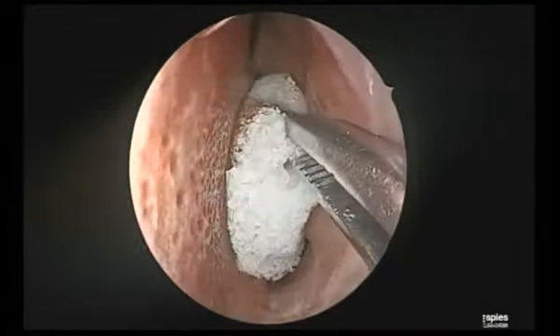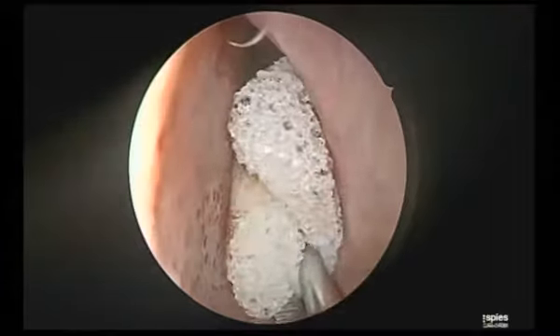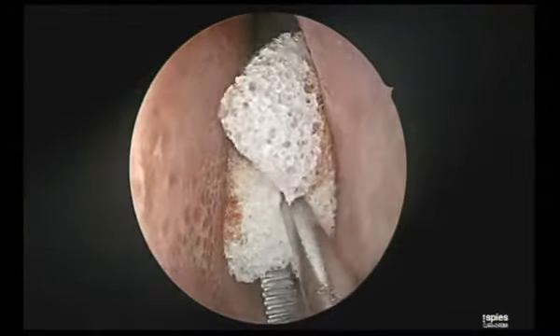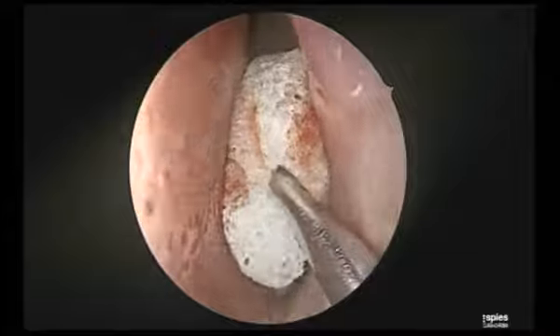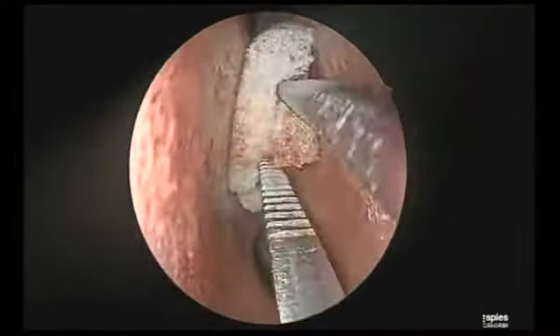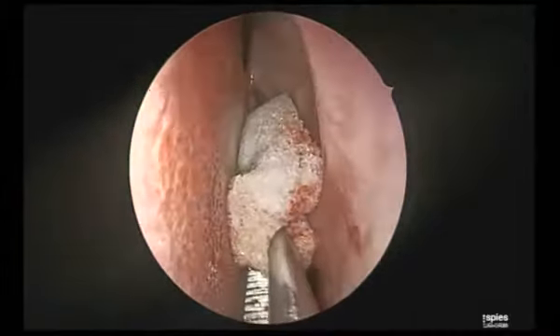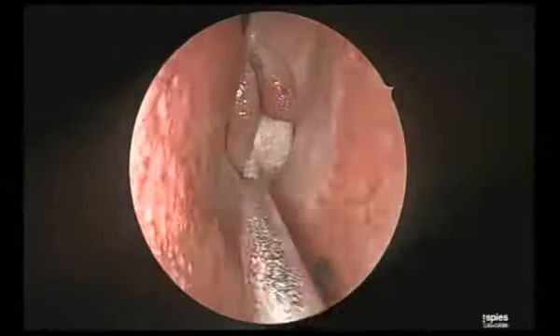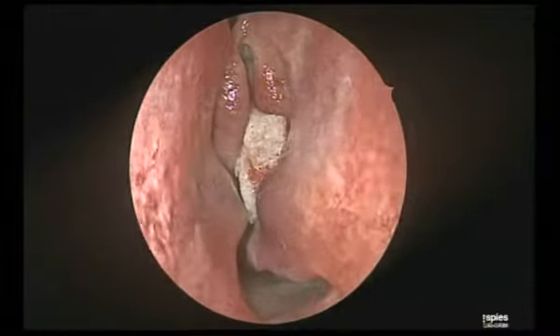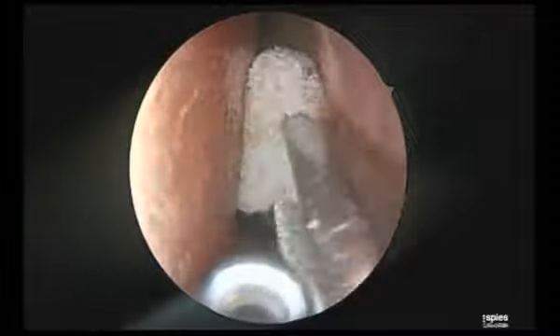You can see I'm pressing on the columella with the instrument, so I can converge. The next thing is, if I'm using an instrument and going in, I will bring my instrument here and then follow with the endoscope. If you are bringing out, follow with the endoscope. This should be a coordinated movement, which is very, very important. So we do everything under vision. We don't traumatize the opposing surfaces of the nasal septum and the turbinate, which can otherwise lead to synechia and crusting later on. That's very important in the post-operative period when you see the patient.